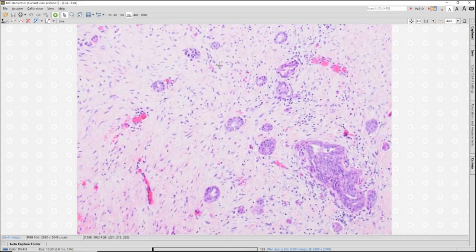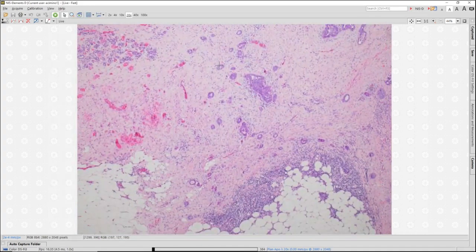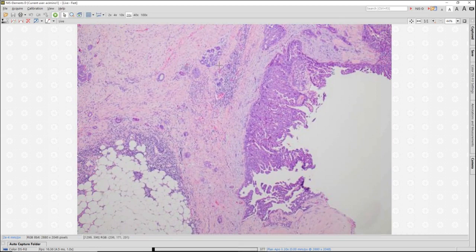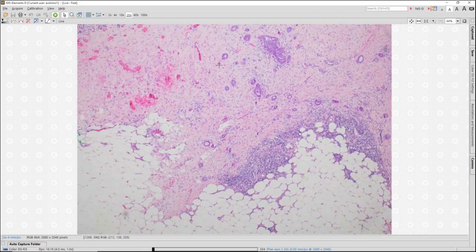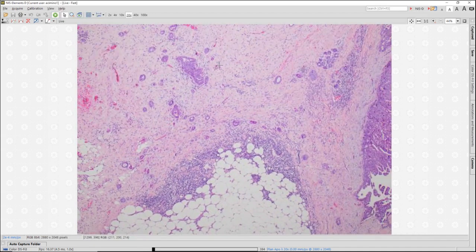This can be treacherous because they don't always have myoepithelial cells around them. Imagine if you just pulled out some of these usual hyperplasia cells and just pulled them through. They wouldn't have the myoepithelial cells accompanying them. So if myoepithelial cells are present on the stain, that's great. If they're not there, you have to use the clues of a linear row of cells with accompanying features of biopsy site and needle tract changes. All right, so I want to point that out as important features.